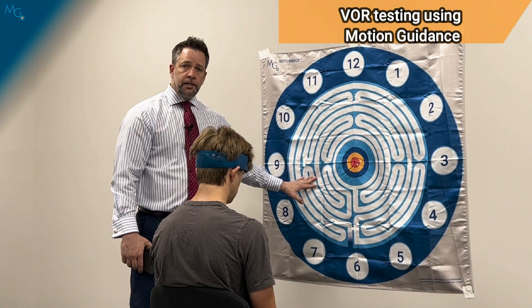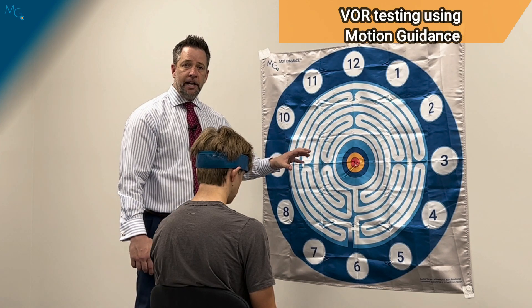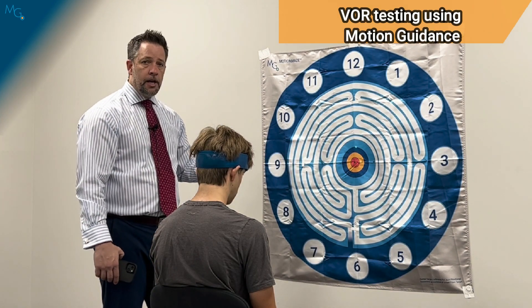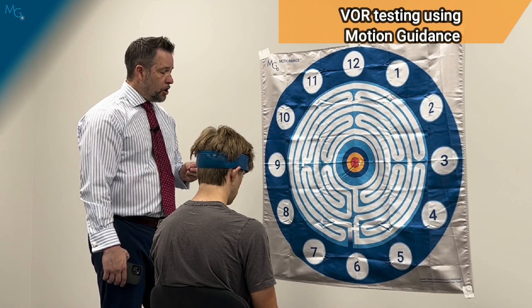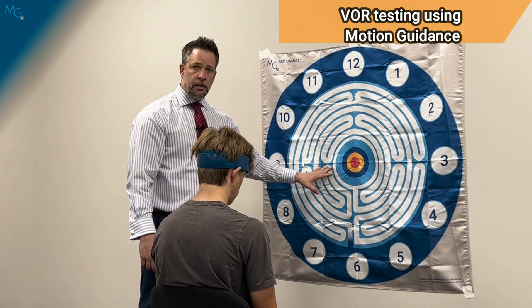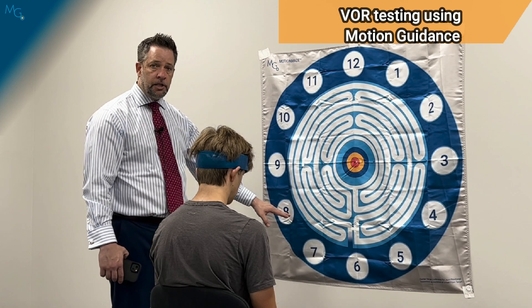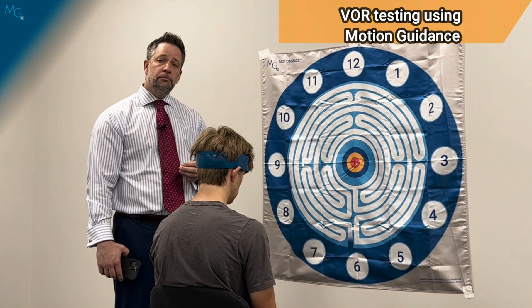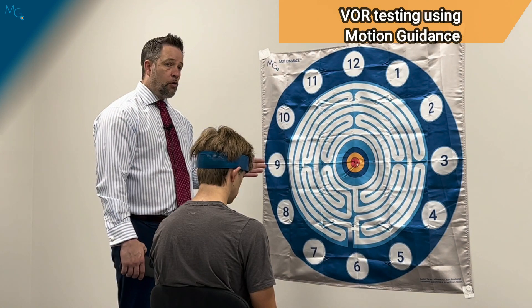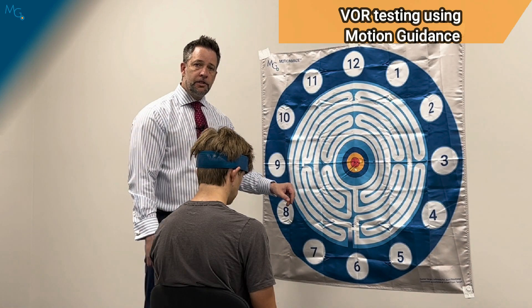This is how you perform and score a good test. The motion guidance device value comes from detecting when a patient tries to change the test — consciously or unconsciously — to avoid having their symptoms, because they know that this particular test will provoke them. We'll see that show up as a pattern on the laser. For example, if their gaze fixation is at the six but they know that looking toward the left with their head causes symptoms from vestibular hypofunction, they might avoid that direction.